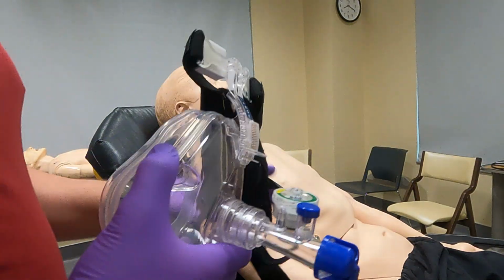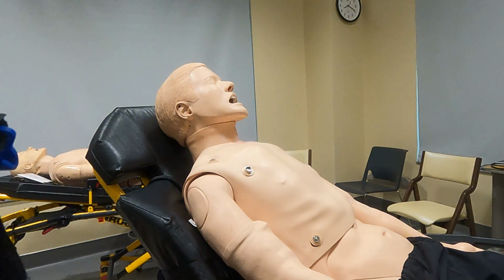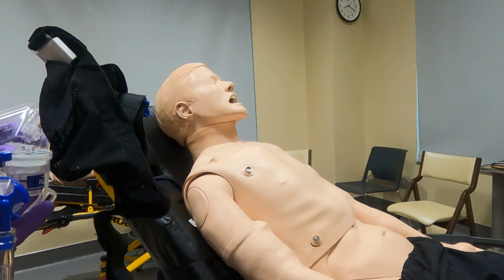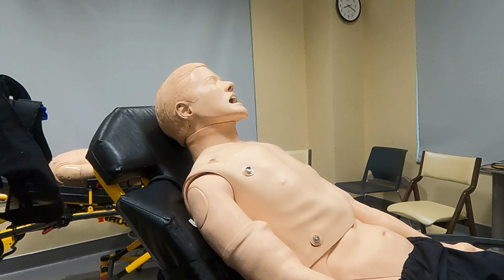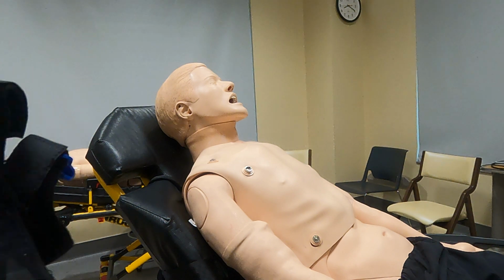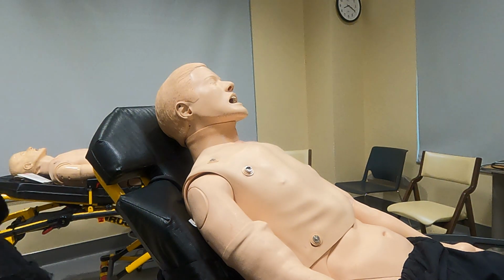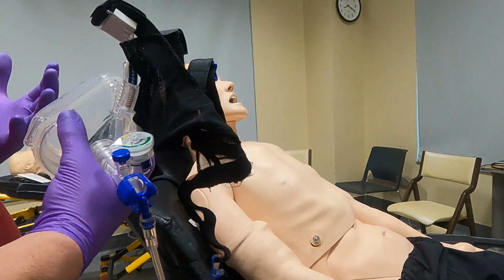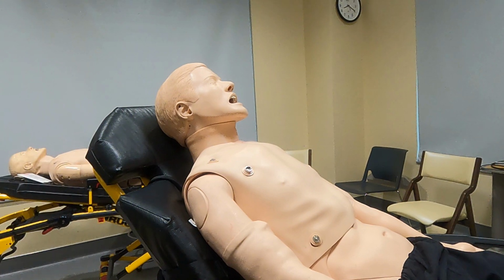Now with our oxygen on, the first thing I'm going to do is talk to my patient and be like, all right, sir, I'm going to put you on a device. It's called CPAP. What it does is it's going to blow air really hard into your face, and it's going to give you something to breathe out against to force your airways open, which is going to help you breathe better. It does feel really strange, so I'm just going to hold this up to your face for a minute so that you can get used to it.